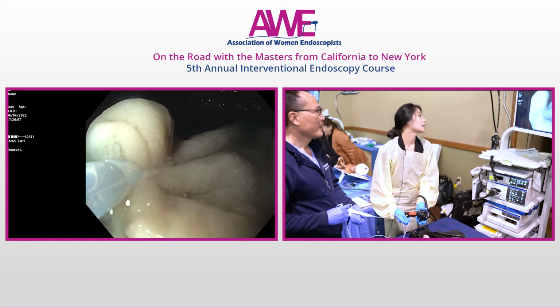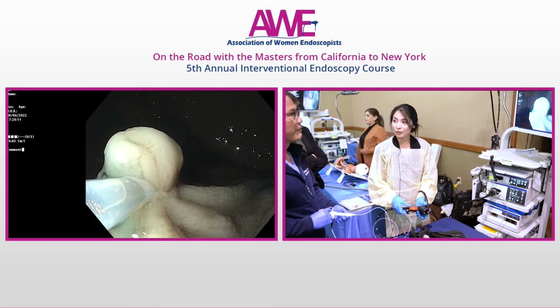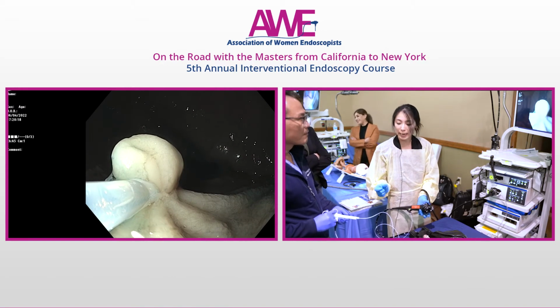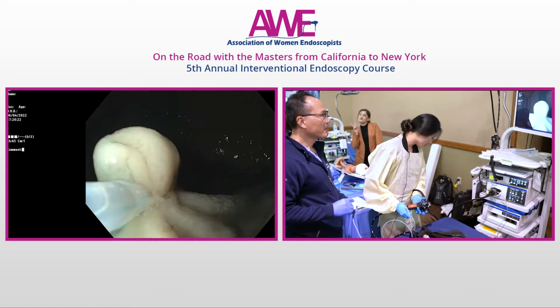Okay. Nice job. So we could potentially cut all the way through cold here, and we're trying not to do that. We want to take this one hot. We've made that decision. So we're just going to close until we're tight, and he's going to give me feedback that he's tight there. And then we're going to slowly cut through.